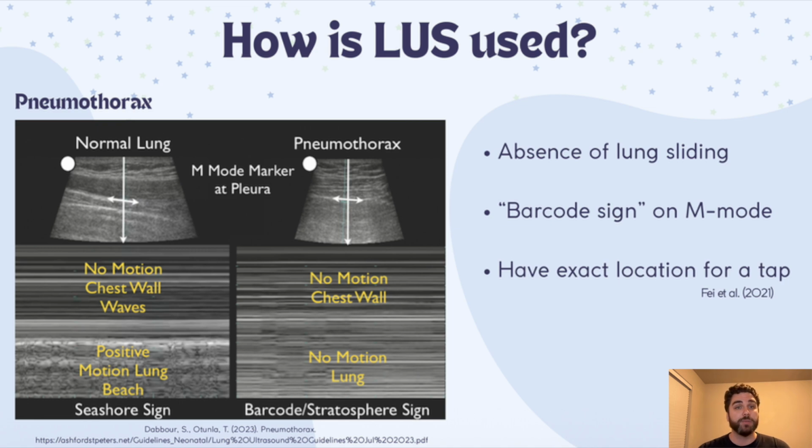But what is very nice about this is that now you know exactly where to tap this pneumo, right? Because you're looking at this straight beam, and as you're navigating it and moving around, you can tap at that exact location and grab the pneumothorax and alleviate that, which is great.